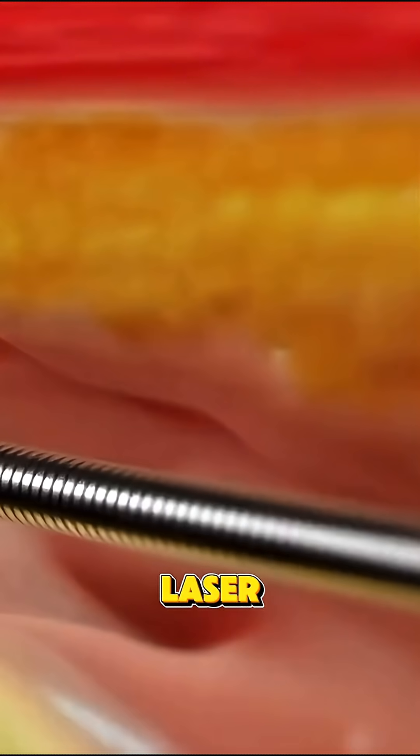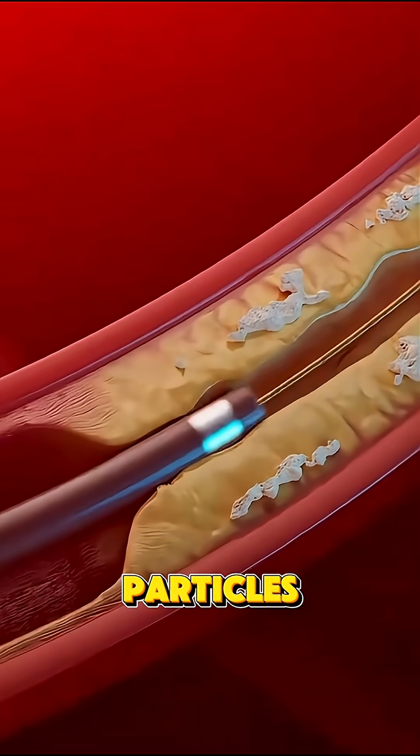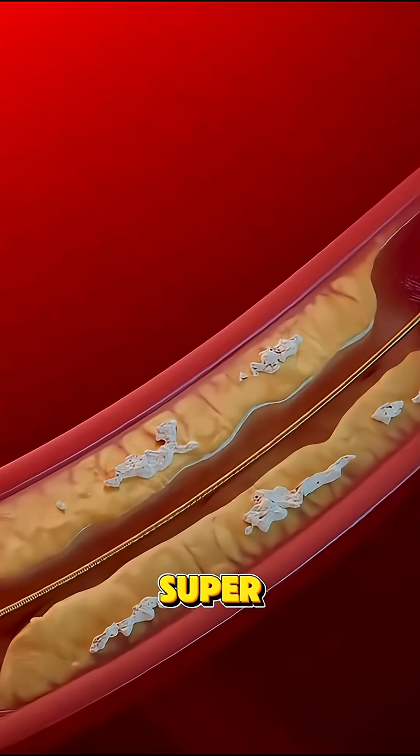Once in place, a laser fiber at the catheter's tip emits pulses of ultraviolet light that vaporize the plaque. It literally turns it into gas and tiny particles without harming the artery wall.